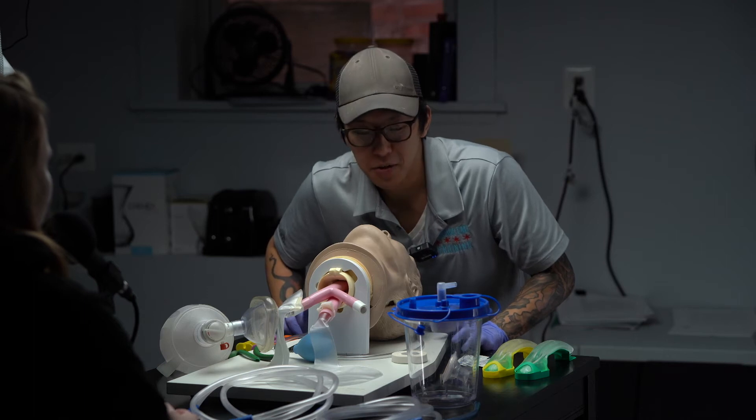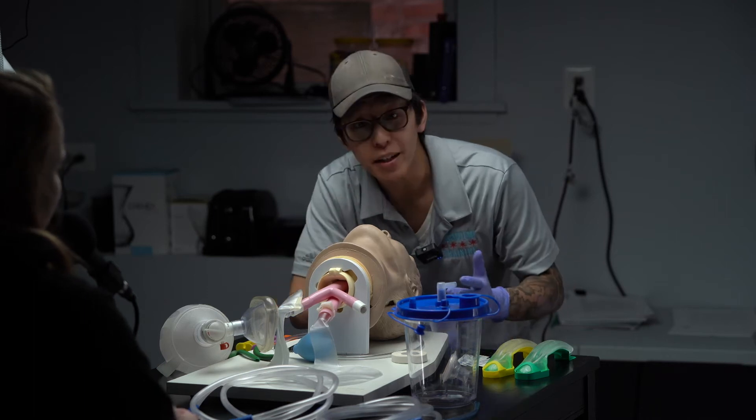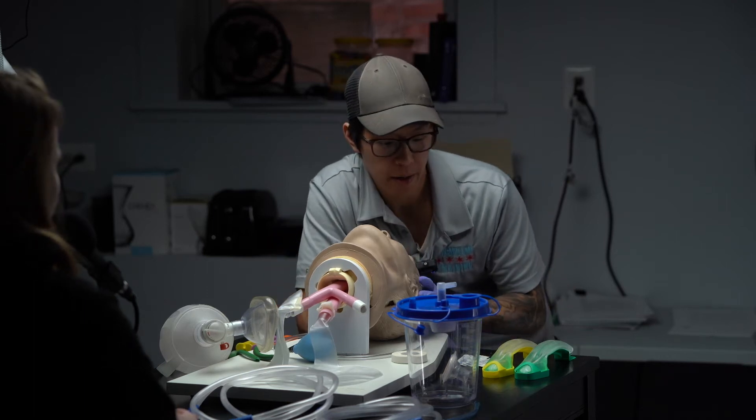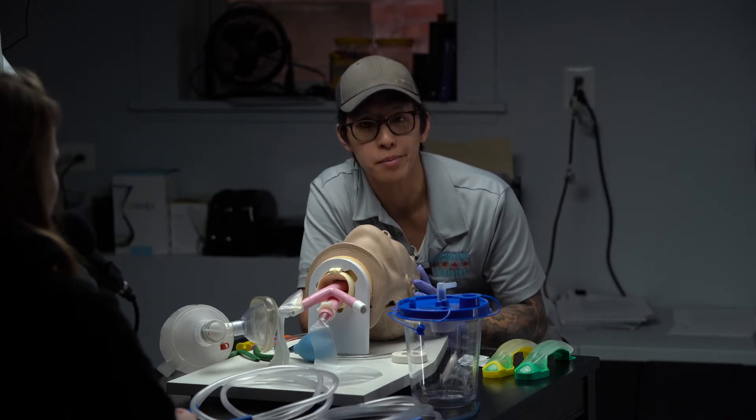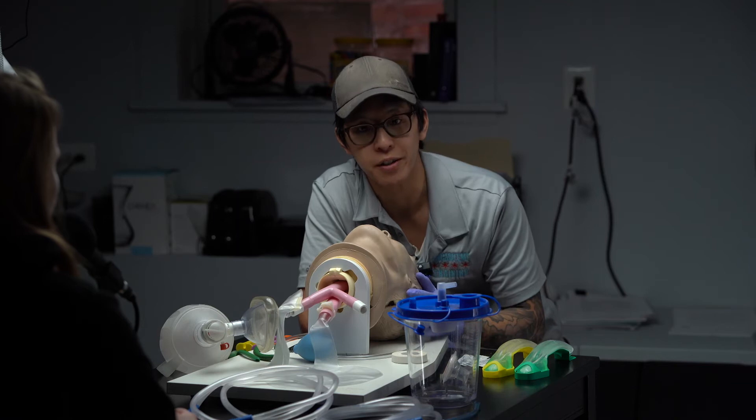What's going on everyone? We're going to do an airway management updated video with the supraglottic airway. We typically give our students about 10 minutes to do this, but on average it should take you about five to six minutes.